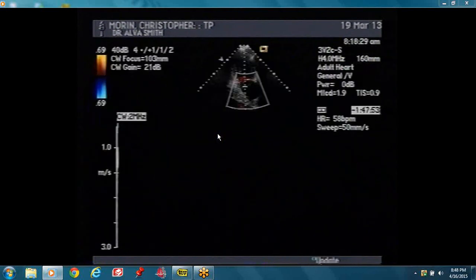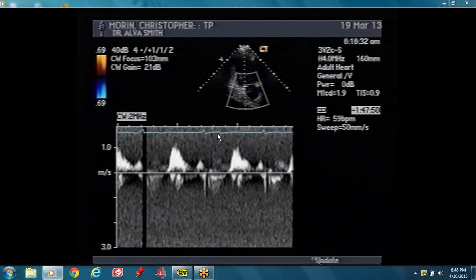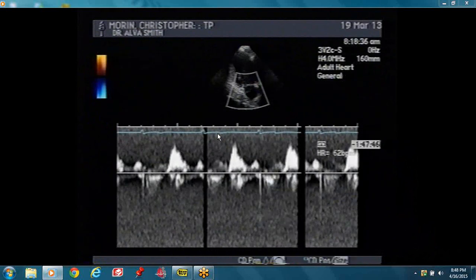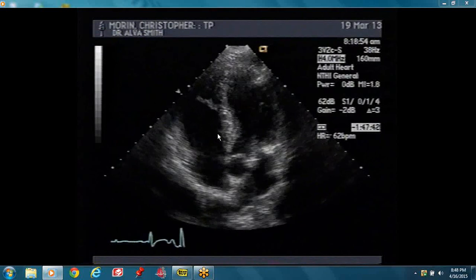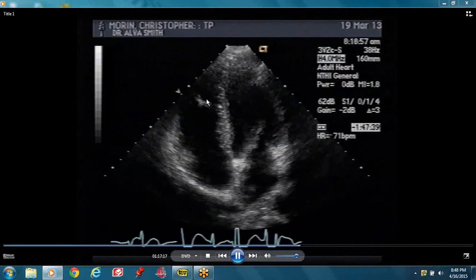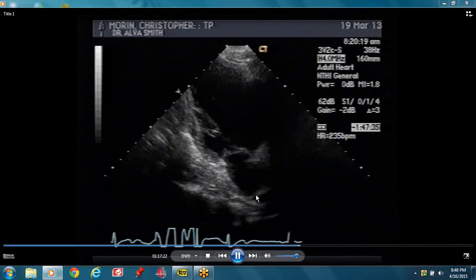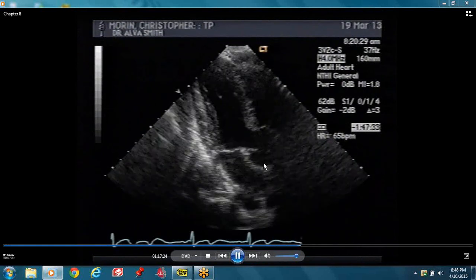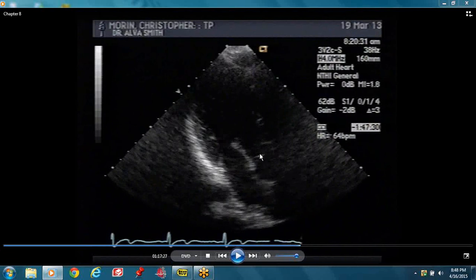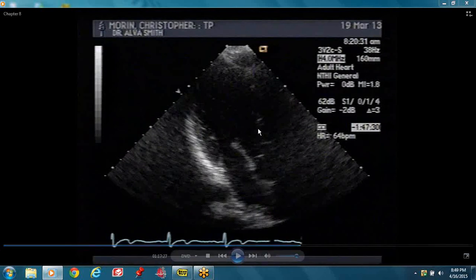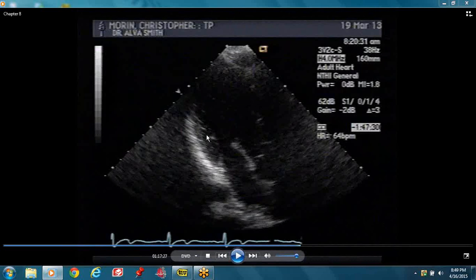Akinesis — there's no thickening at all. Five chamber view again shows the moderator band. Once you get to five chamber view, you'll see the moderator band. This is our three chamber view. With the three chamber view, you have your aortic valve and the aorta. This wall is your inferior lateral and this is your anterior septal.